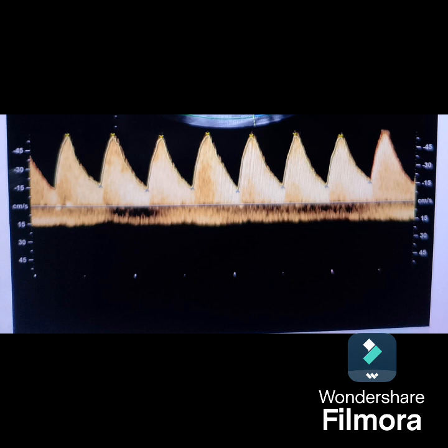Or if the middle cerebral artery flow is showing brain sparing effect. So these two things will show that even if it is 34 weeks, it can be delivered.